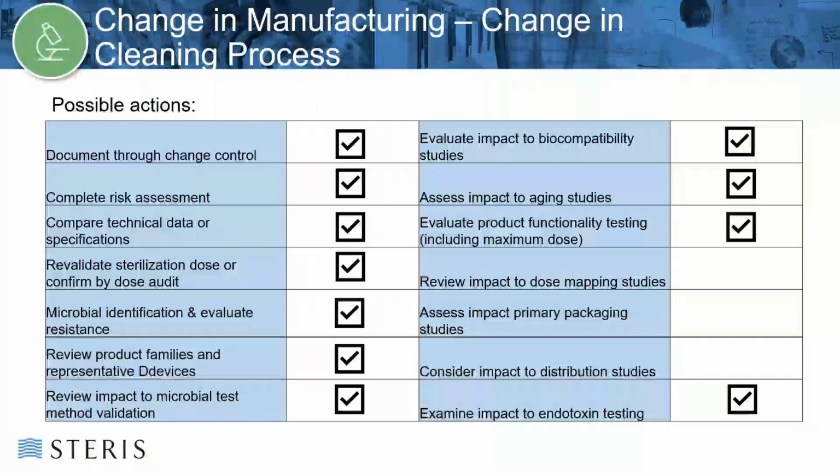Assessing the appropriateness of product for inclusion in a product family as representative device.